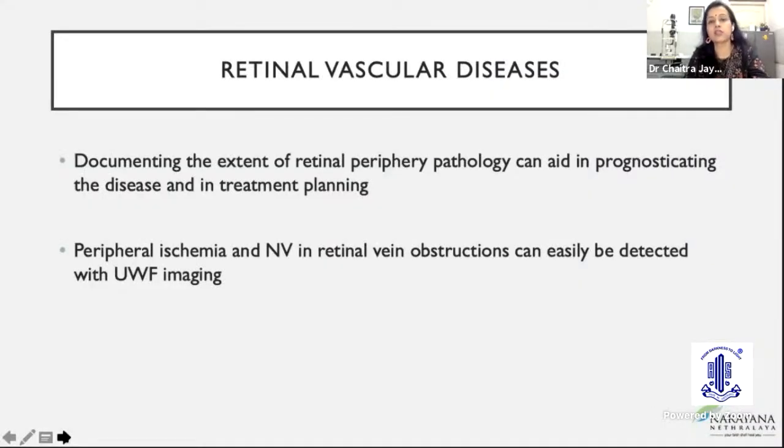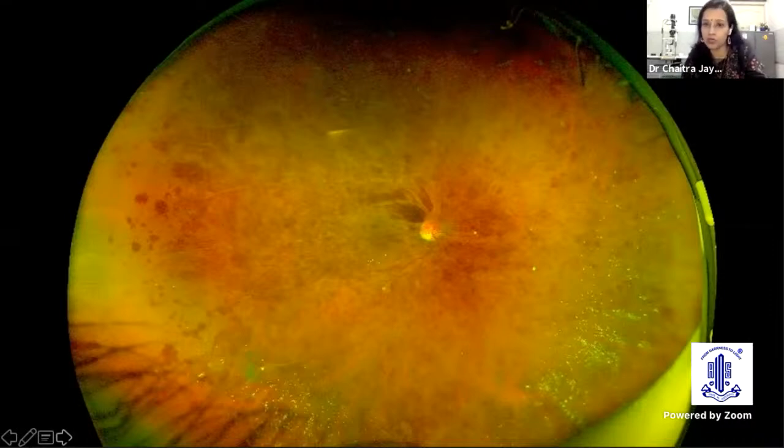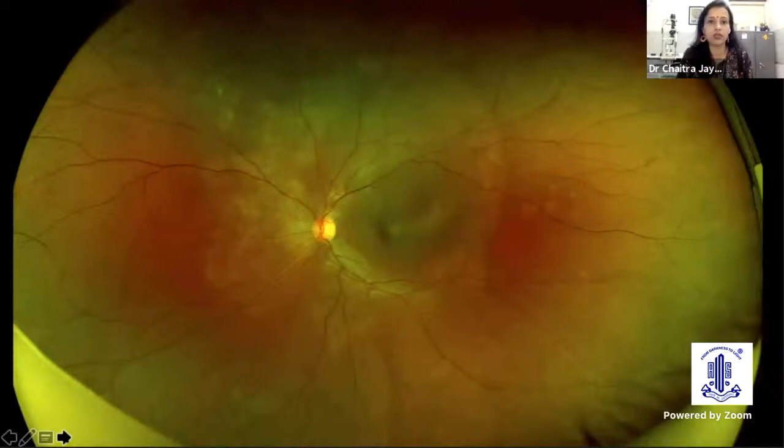So other retinal vascular diseases, especially where more of the retinal periphery is involved, peripheral ischemia and neovascularization can be easily detected even if it's missed clinically. So this is a patient that walked into our clinic yesterday with CRVO. It's so easy to explain to the patient, especially in comparison to the other normal eye. You can also see asteroid hyalosis in this patient. So you can tell them, you see the extent, it's going far up to the periphery. So obviously the ischemia is expected to be more. Eventually the patient would probably need laser treatment. As of now, intravitreal injections to manage the macular edema.